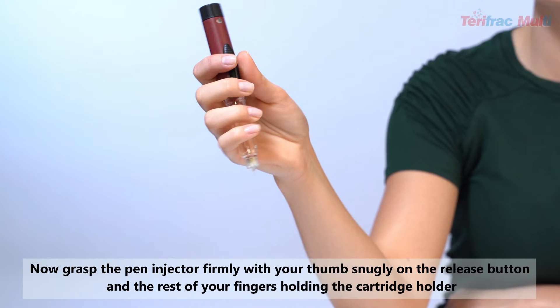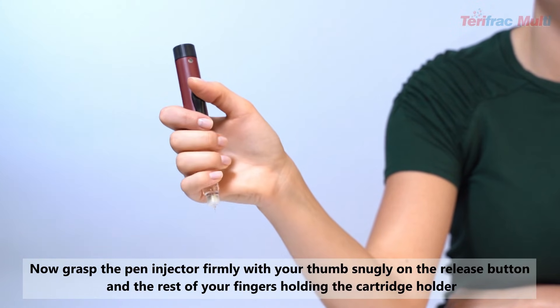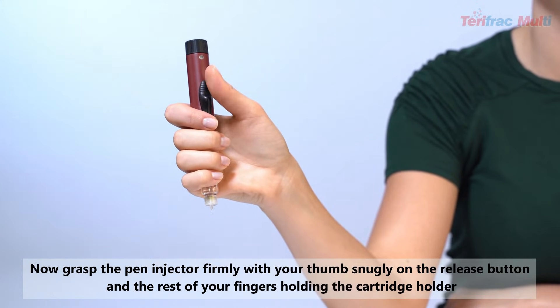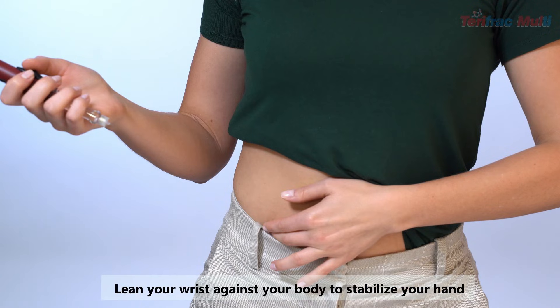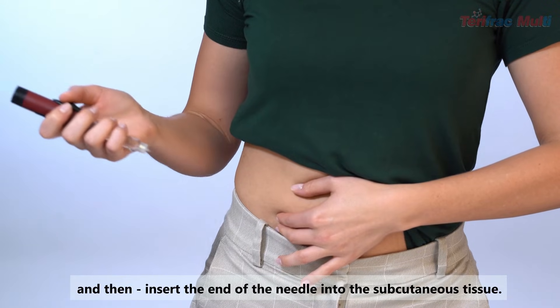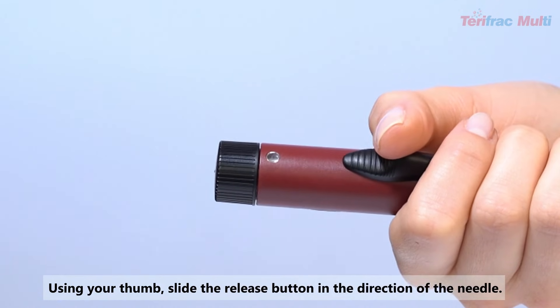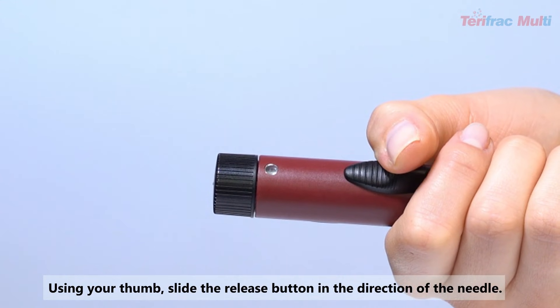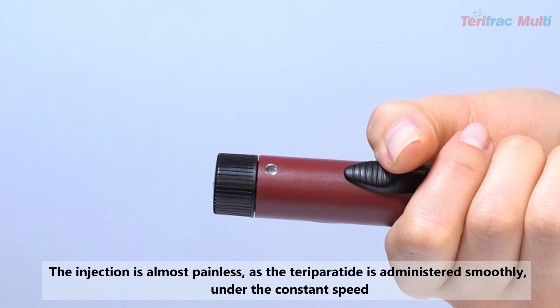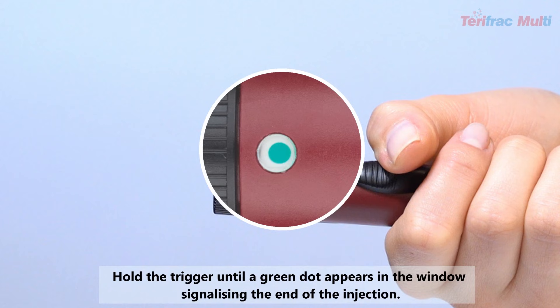Inject dose: Now grasp the pen injector firmly with your thumb snugly on the release button and the rest of your fingers holding the cartridge holder. Lean your wrist against your body to stabilize your hand, and then insert the end of the needle into the subcutaneous tissue. Using your thumb, slide the release button in the direction of the needle. The injection is almost painless as the Teriparatide is administered smoothly at a constant speed.